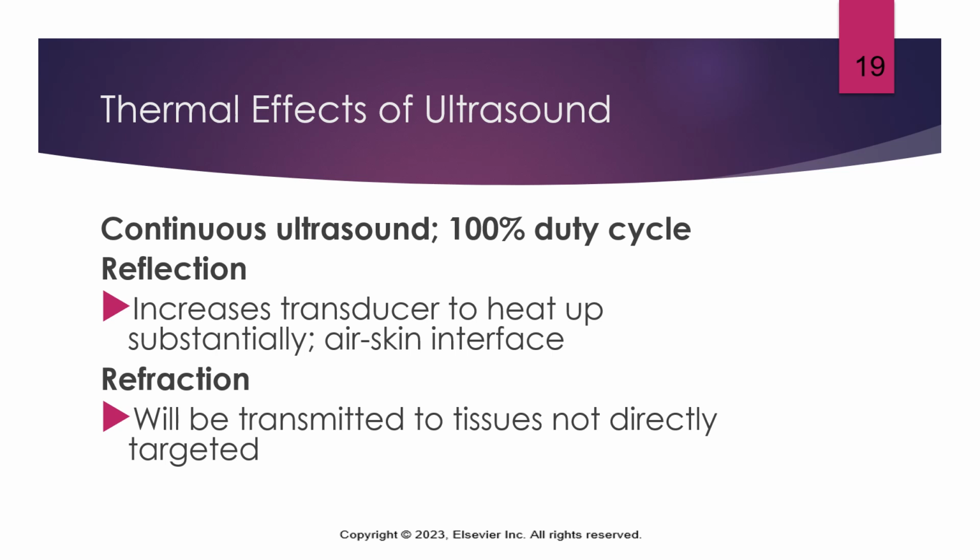So again, you just have to think about the reflection and the refraction. Remember that the reflection increases that transducer to heat up substantially. We have to think about this air-skin interface.